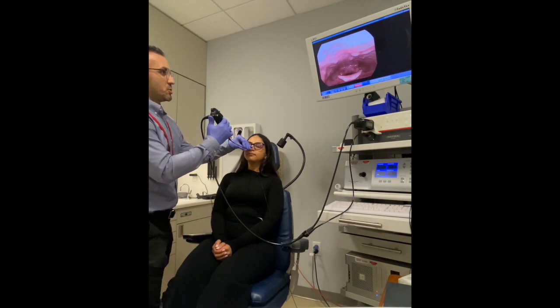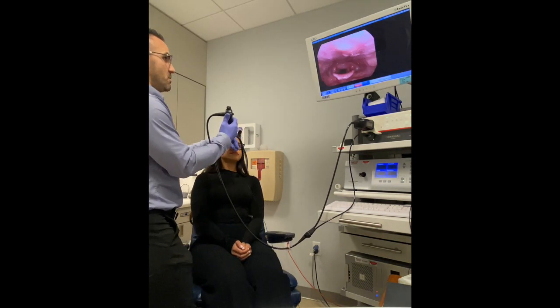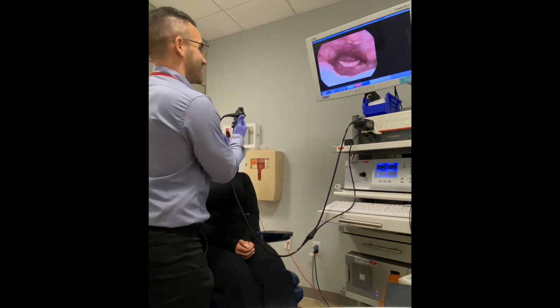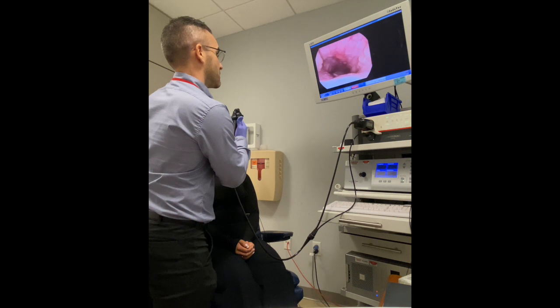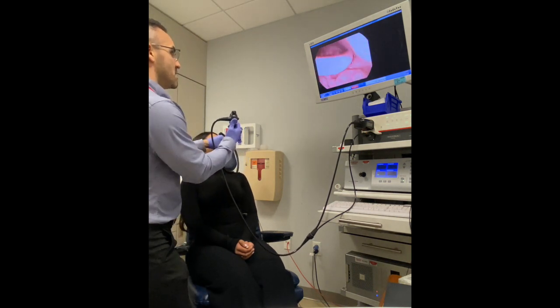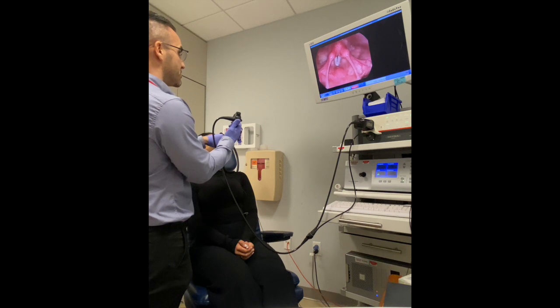What I'm going to do now is turn you to face this monitor. Can you see the monitor okay? — Slightly. — I'm going to see if I can adjust that. Can you see the monitor now? — Yeah. — Go ahead and say E for five seconds, and I want you to see those middle white strips of tissue in the middle of the screen.